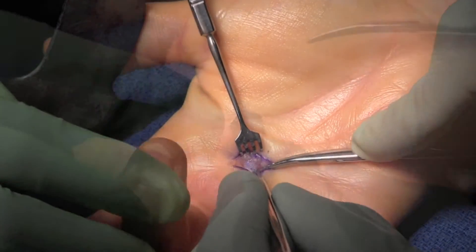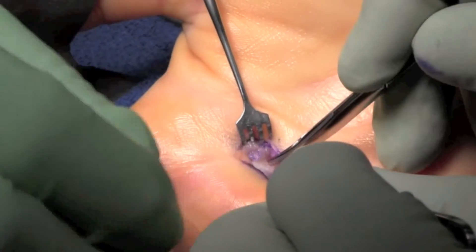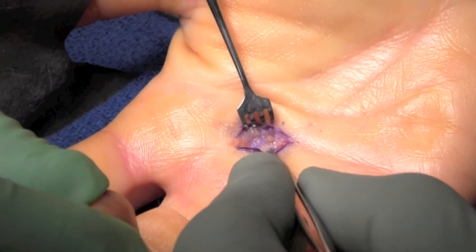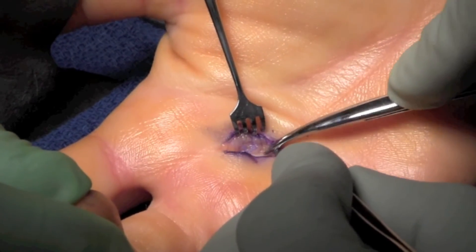At this point, we typically ask the patient to flex and extend the finger if possible as well. You can see there's some slight bulkiness there because the tendon has lost its restraint. We release a little bit more proximally here just to ensure there's no catching.